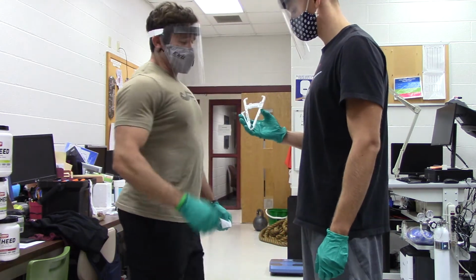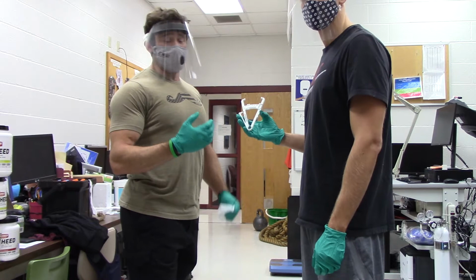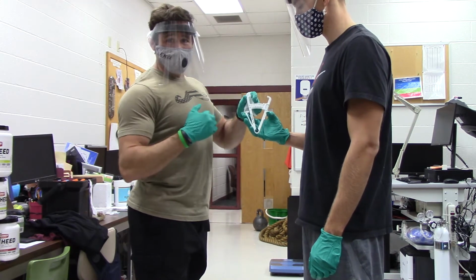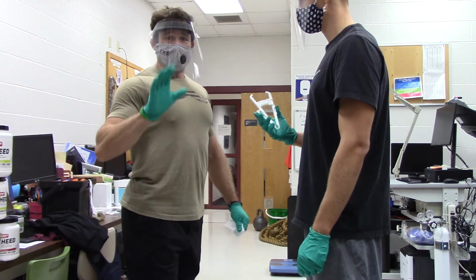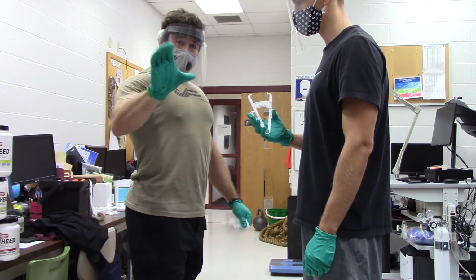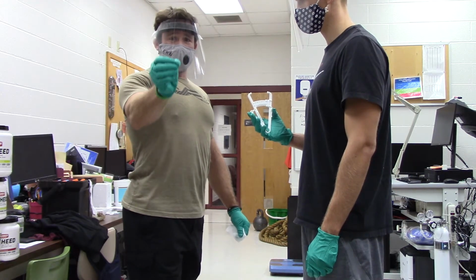And he's going to have that measurement. We go ahead and write that down. And notice when he finishes, he's going to push this dial back out. So he's going to open up and be able to take the full measurement. Now, you're going to feel the bony part of the bottom of the scapula, and you're going to grab on that diagonal. Most other skin folds we're going to grab are going to be vertical.